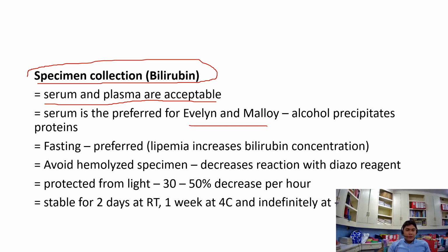Okay, so the preferred specimen for bilirubin is fasting, but usually in the laboratory setting, most institutions do not require fasting for bilirubin as long as the specimen is not lipemic. Regarding lipemia, it increases bilirubin concentration.